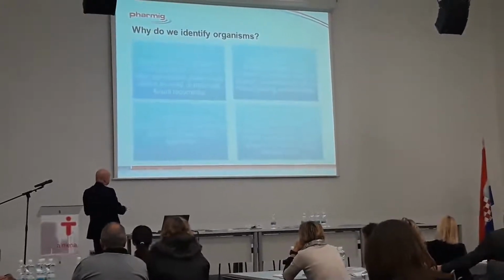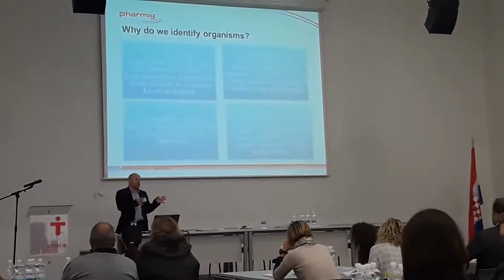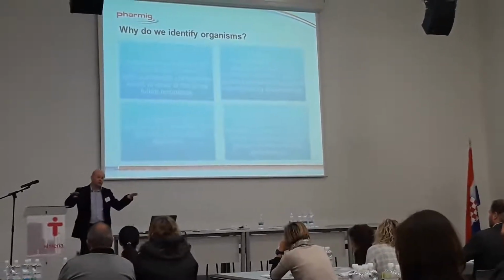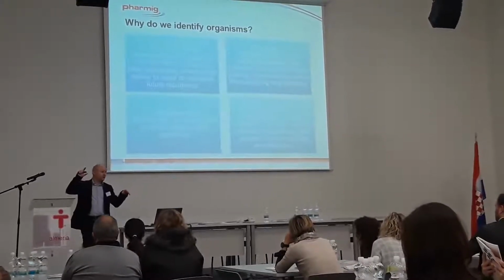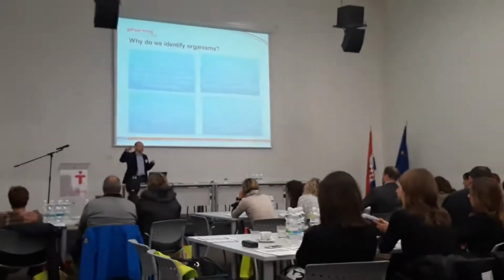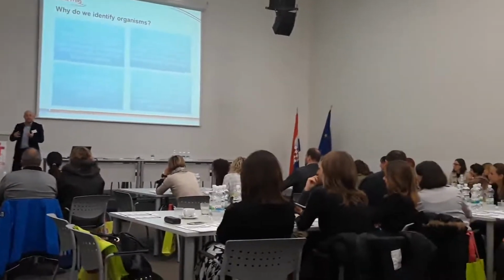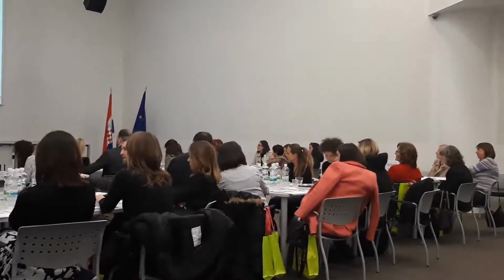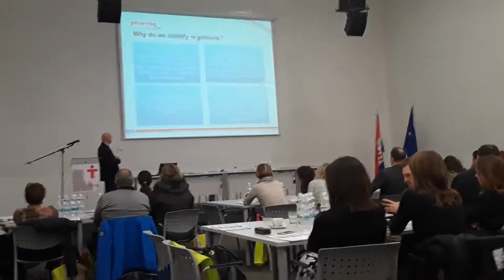But trending, that's when we start to use our ID systems to say, do you know what? Something has changed in the clean room. Here's our normal level of identification. Here's our normal clean room bugs that we see. And now I'm seeing something different. And if I've got confidence that my ID system and my microbiologist isn't a chump, I'm not sure how that translates over here, but a chump is not a particularly good microbiologist, then you will have an indication that something has gone wrong in your clean rooms. So these are the two routine and important principles for microbial identification.